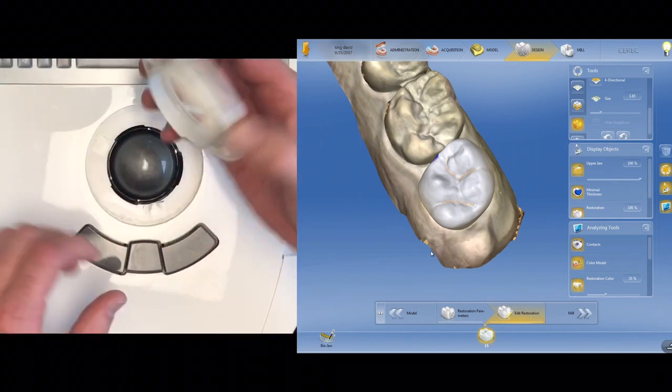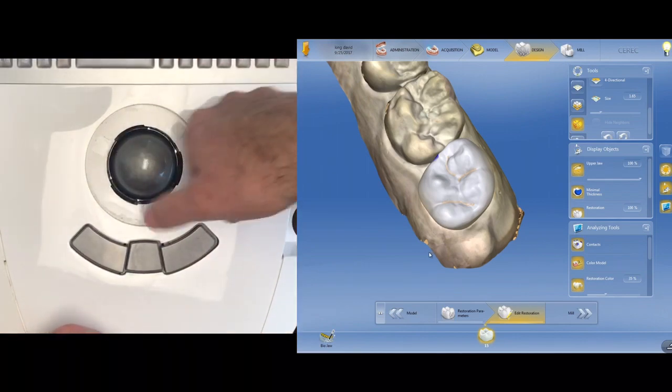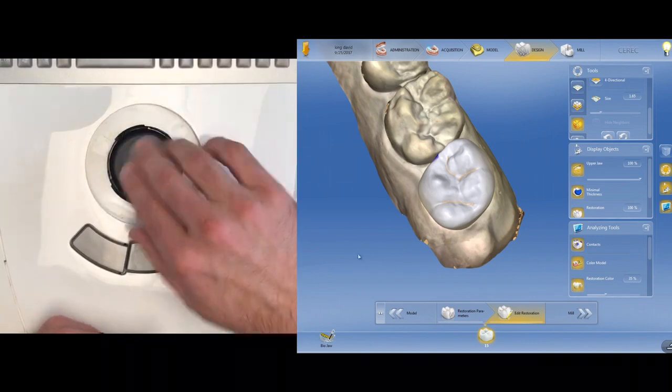If you'll notice, you can take this off. It just unscrews counterclockwise. The ball can be removed, blasted out with some air to clean any particles out of there to make sure it's free moving.